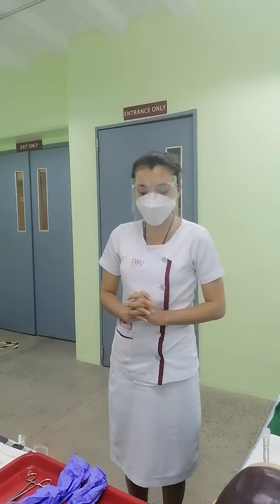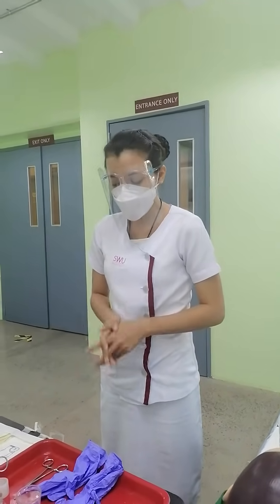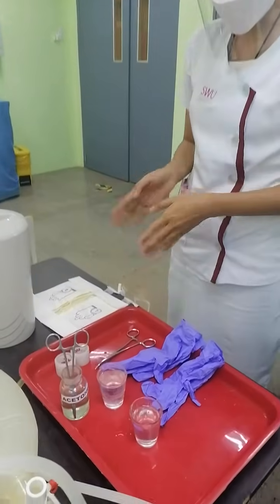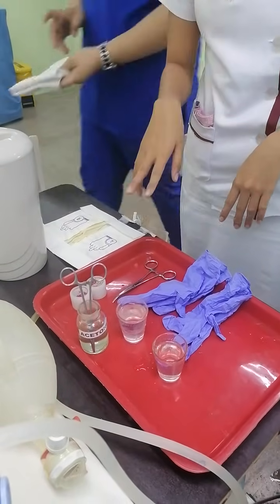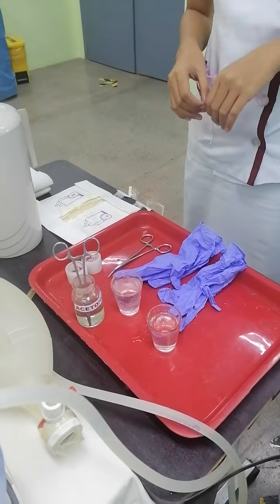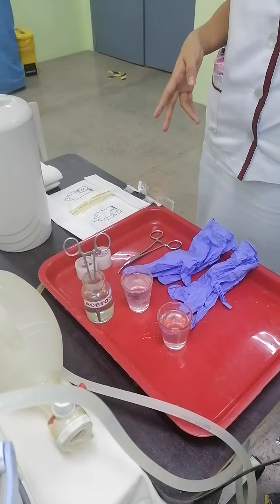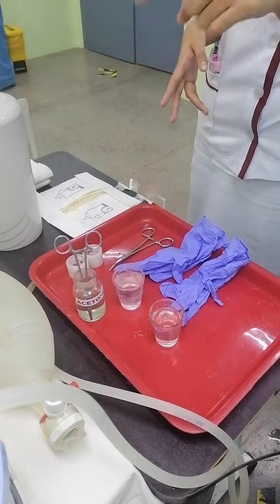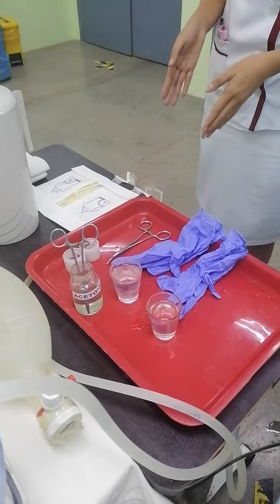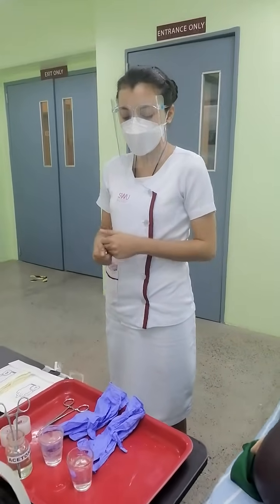Next is to assemble and prepare all the materials in order to save time, effort, and energy. The materials needed are clean gloves, sterile gloves, the picking forceps, two pieces of sterile containers filled with normal saline solution, the tape, the resuscitation bag, the connecting tube for the suctioning machine, the suctioning catheter tube, and the towel.